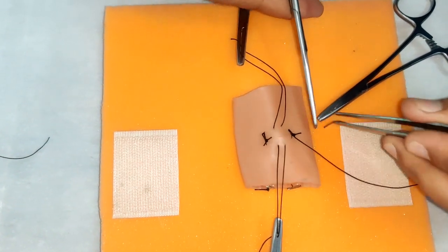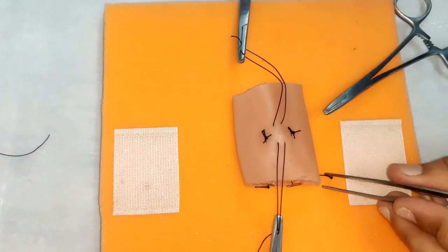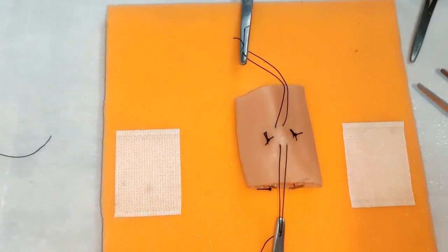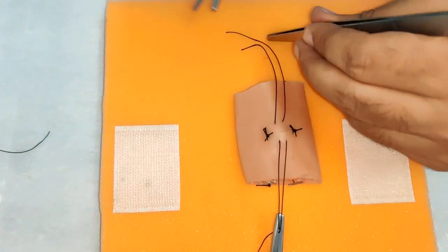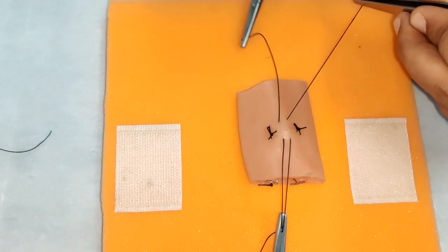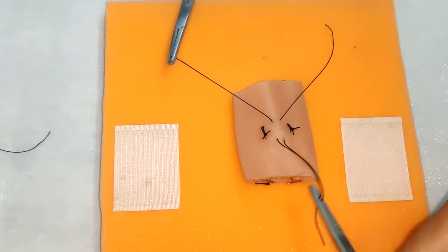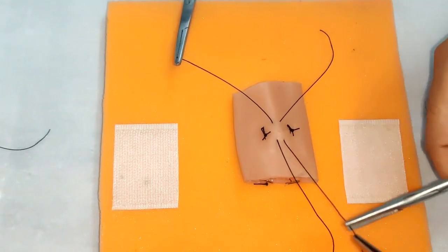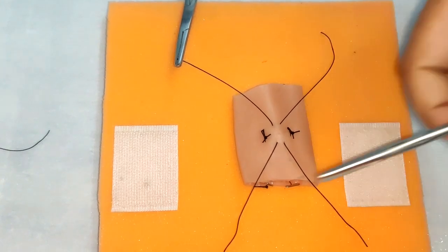We will make sure that we are not mixing the threads while suturing in this type of technique.